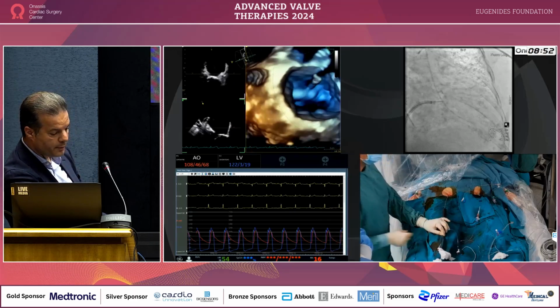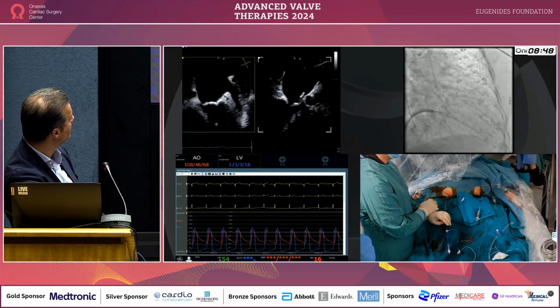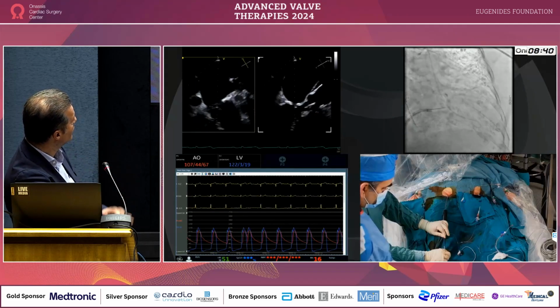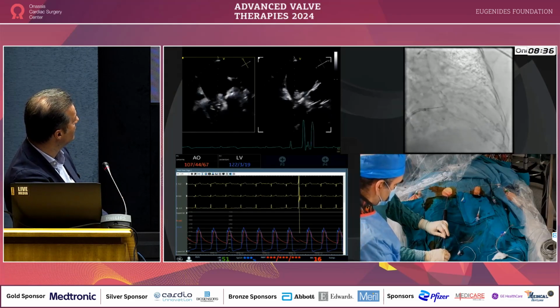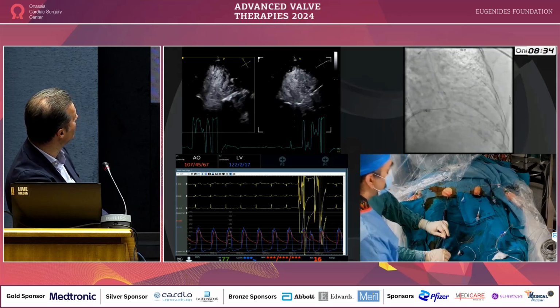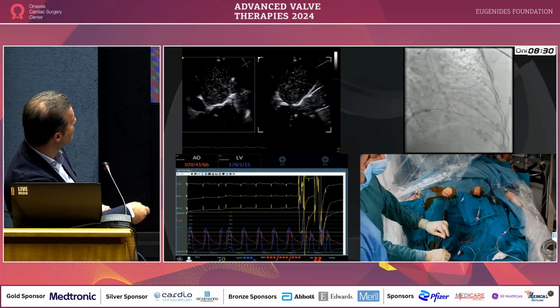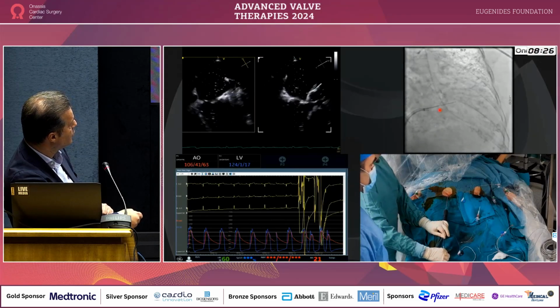So we're happy with the position now, and then we will cut through in a minute. We're measuring the distances between the tip of the leaflet. We just spend our time trying to make sure, and this is, I think, the cutting. See, there were some bubbles, but you can see how the wire moved towards the LV now. Of course, not very far.